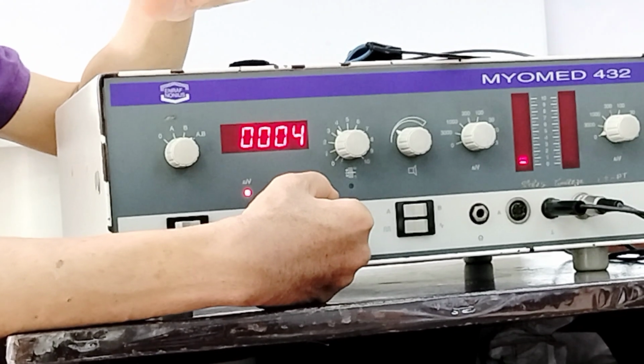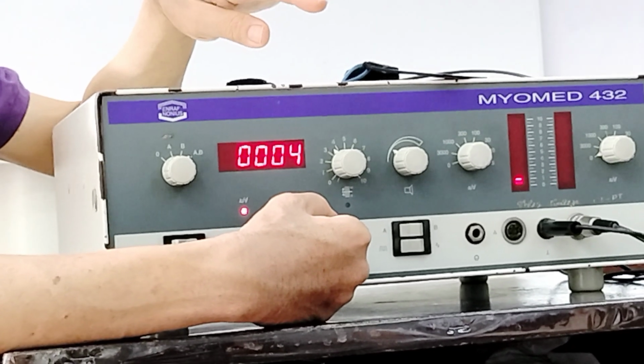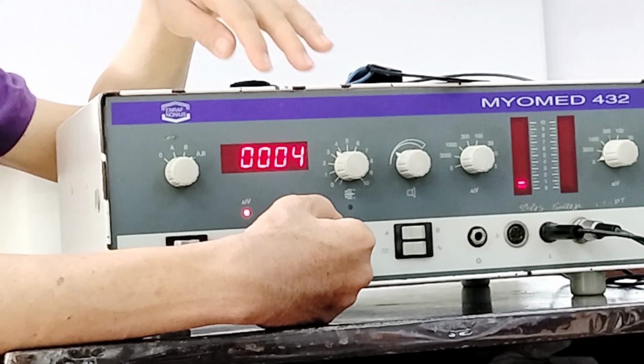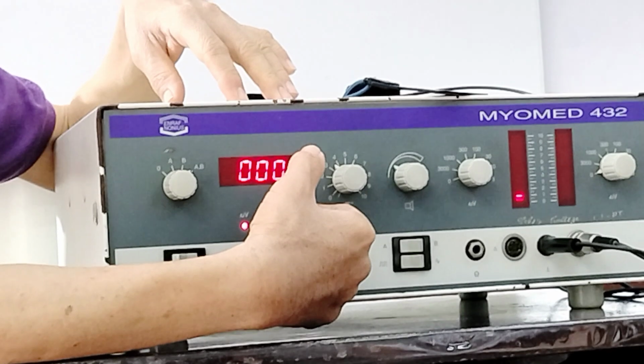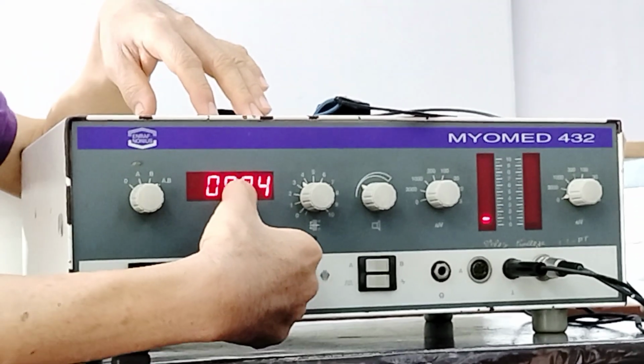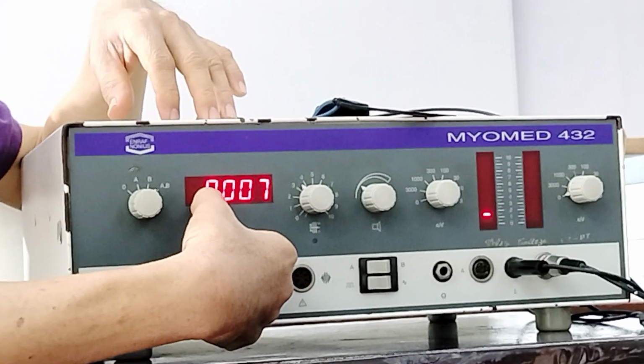For example, if channel A is 12 microvolts and channel B is 7 microvolts, 5 will appear. Since channel A is greater, there is no negative sign.